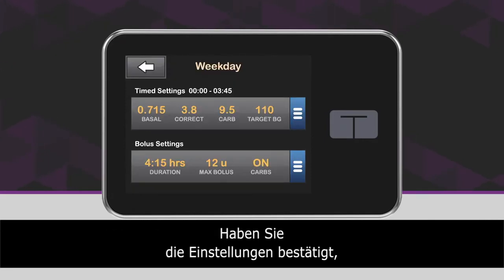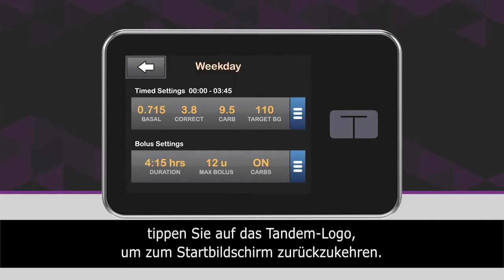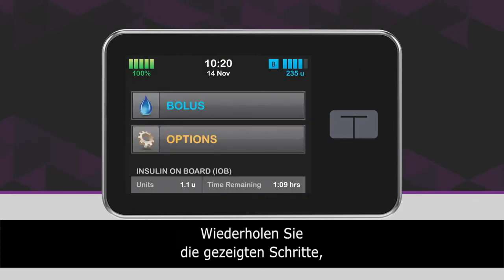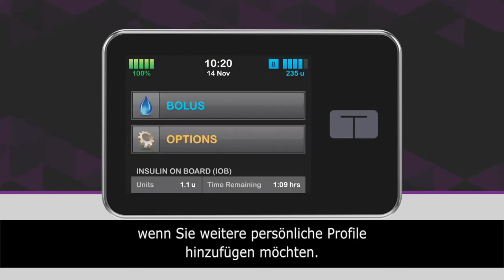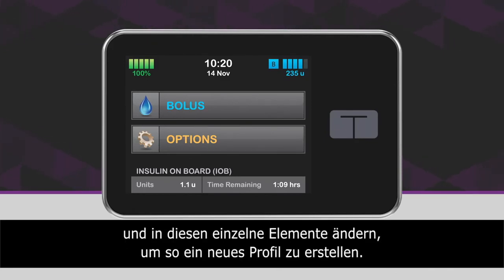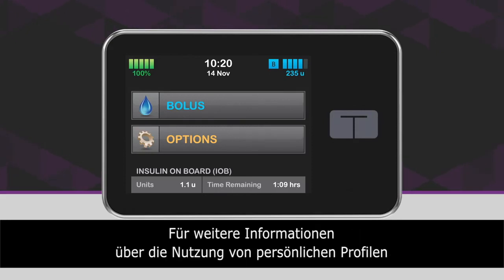When you have confirmed your settings, tap the Tandem logo to return to the home screen. If you need to add additional personal profiles, repeat the steps outlined in this video. You may also duplicate an existing personal profile, then select Edit to change only certain settings to create a new profile. For more information about using personal profiles, please consult your user guide.